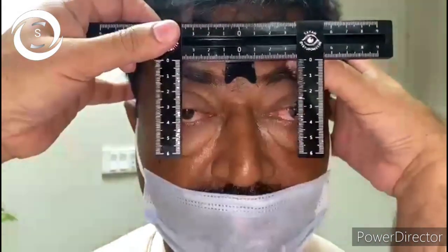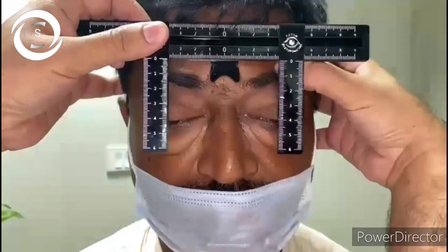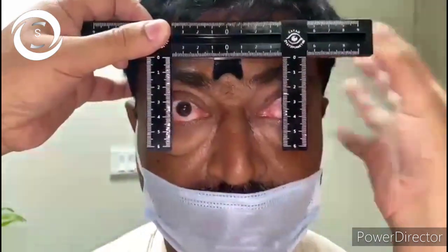And now by holding the frontalis, I am checking the levator function in the left eye. So the patient has got good levator function.